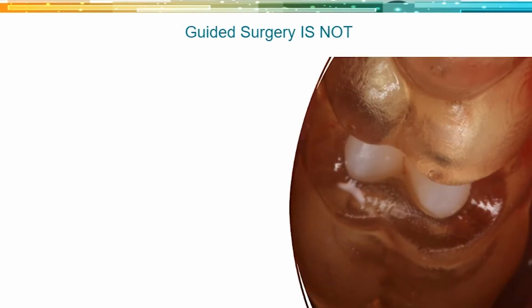What is guided surgery not? Well, it's not appropriate for everything. We'll talk about some examples where it's maybe not appropriate, but small opening, patients who can't open very wide, tight spaces, really trying to nail it. Maybe some of the full arch stuff, especially on the lower. Guided surgery is not a panacea, right? It doesn't solve every problem. So it's not a cure for all problems.